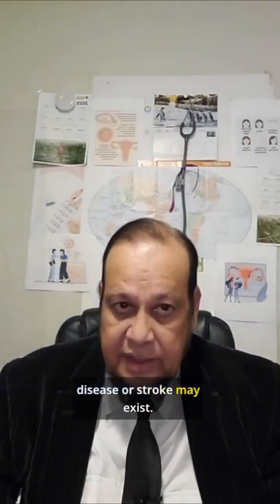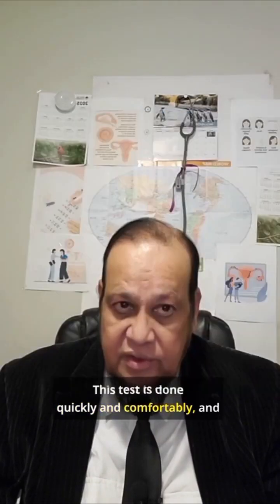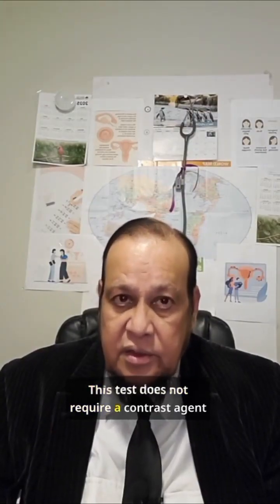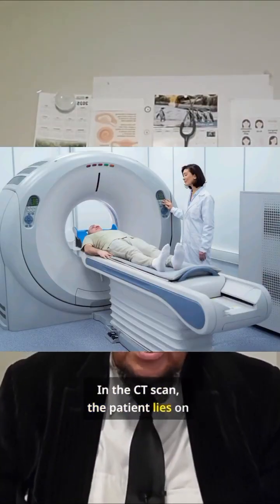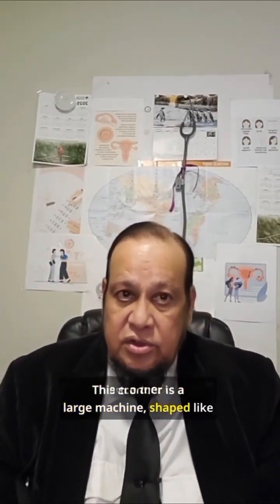The procedure or method for this test is done without causing any pain or discomfort, and during the test, there is no pain of any kind. For this test, there is also no need for a contrast dye injection. The CT scan patient is made to lie down on a table, which then slides into the CT scanner. This scanner is a large donut-shaped machine.